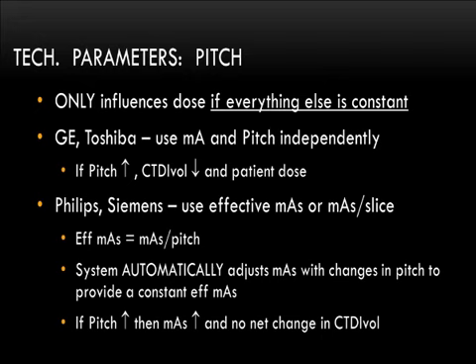So I learned that this slide is slightly incorrect, but it's close. GE and Toshiba use MA and pitch independently. So if the pitch is increased, the CTDI vol will go down, and patient dose will also go down. For Toshiba, that's not 100% true, but it can be true, so you're going to have to look at your user manual on that one. I wish it were always true.